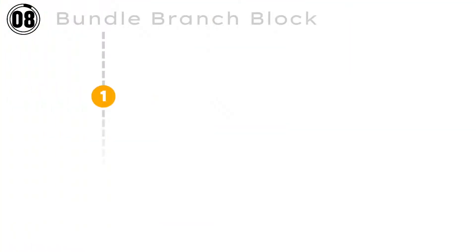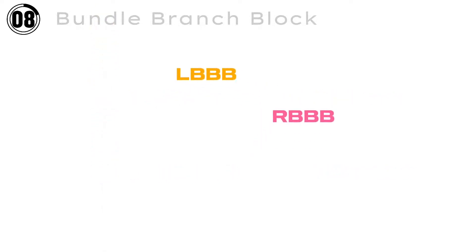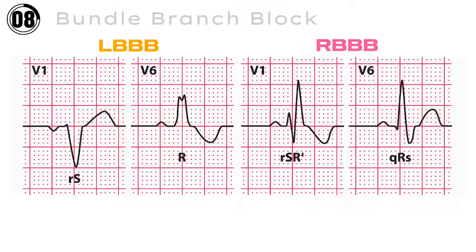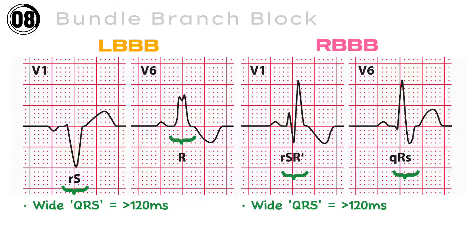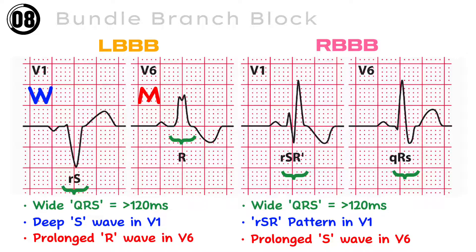ECG number 8: Bundle Branch Block. There are two types: left bundle branch block and right bundle branch block. In both, the QRS complexes are wider, with duration more than 120 milliseconds. In the left bundle branch block, there is a deep S wave in lead V1 and a prolonged R wave in lead V6, making a W pattern in V1 and an M pattern in V6. In the right bundle branch block, there is an RSR pattern in V1 and a prolonged S wave in V6, making an M pattern in V1 and a W pattern in V6.